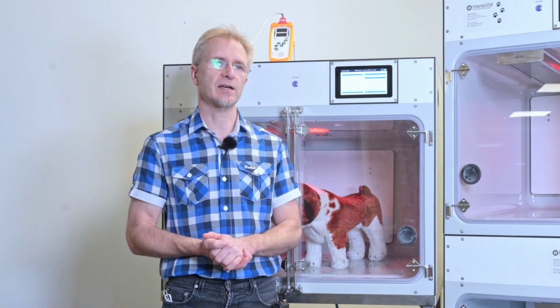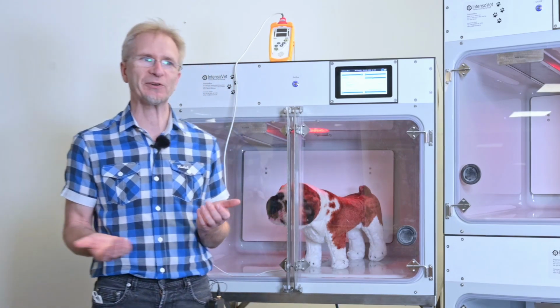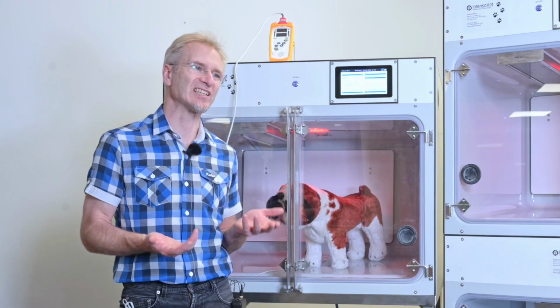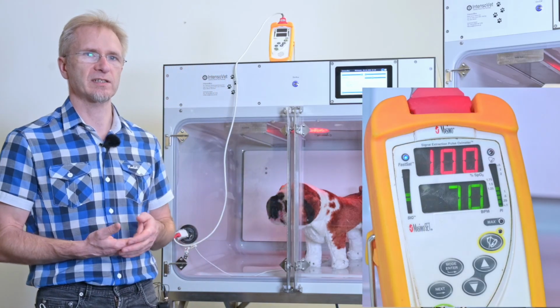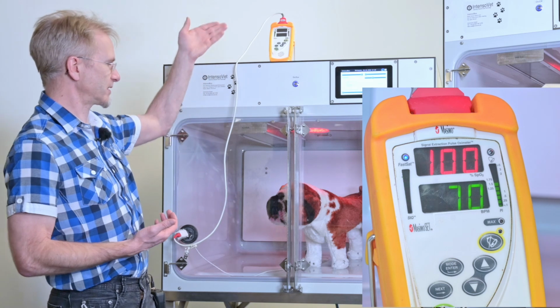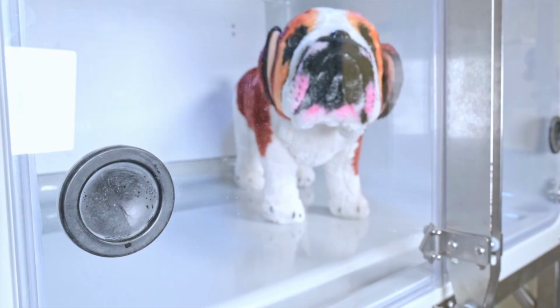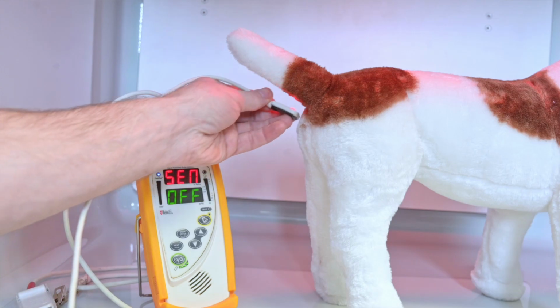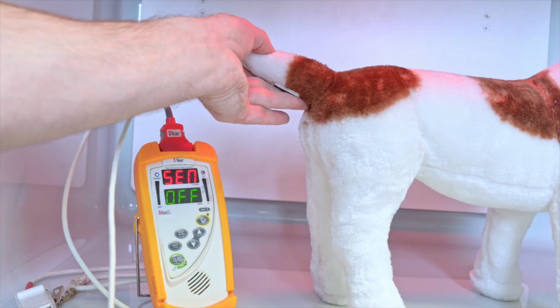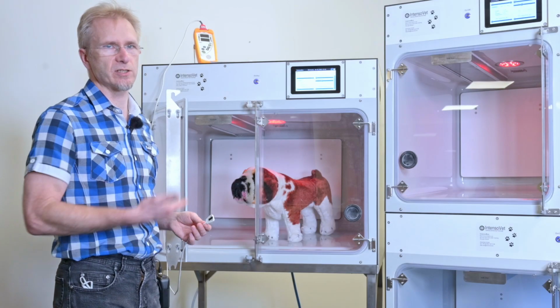The other thing is we could use some apparative monitoring, such as pulse oximeters. And as most of you know, pulse oximetry in dyspneic patients is not really easy to place at the tongue or somewhere. So we especially use a reflecting pulse oximeter probe, as shown here. So here's the pulse oximeter going through the inlet of the Intensobox. If we place the pulse oximeter probe at the tail of the patient, we usually get a pretty reliable signal and get a pretty reliable oxygen saturation reading of the machine.